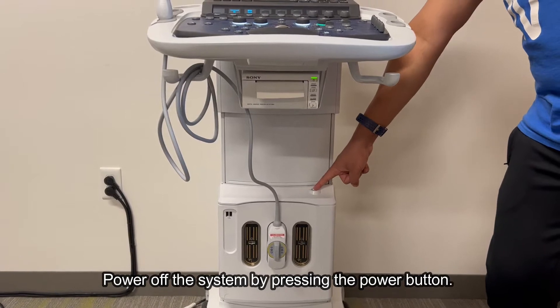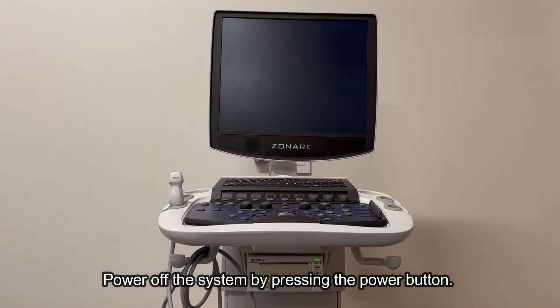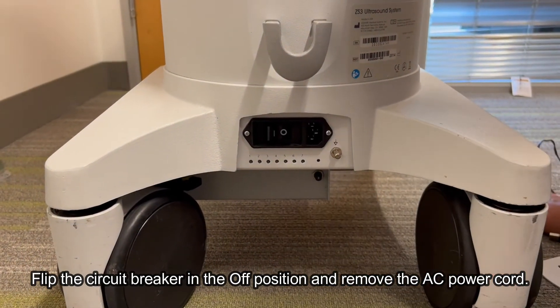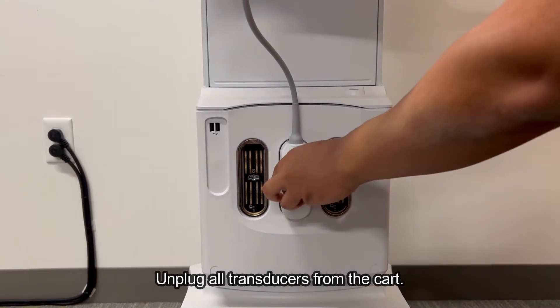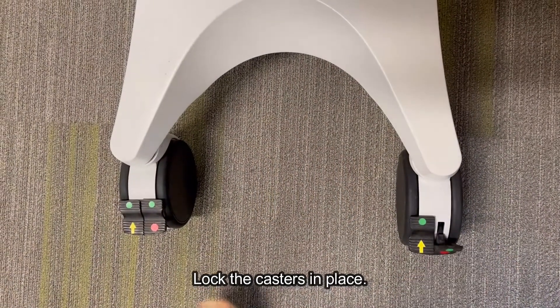Power off the system by pressing the power button. Flip the circuit breaker in the off position and remove the AC power cord. Unplug all transducers from the cart. Lock the casters in place.